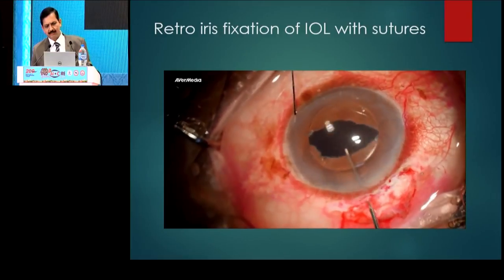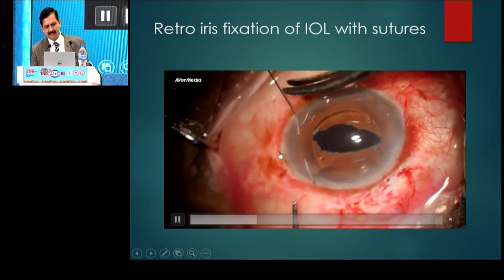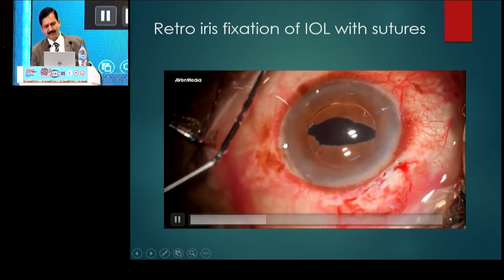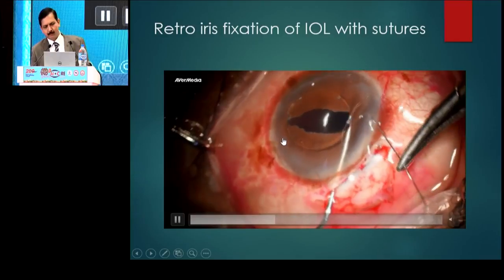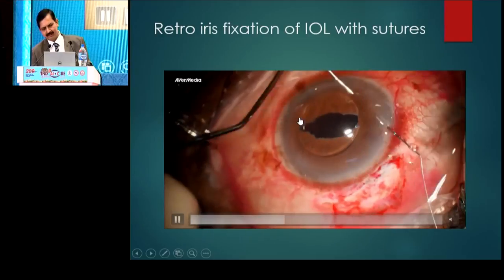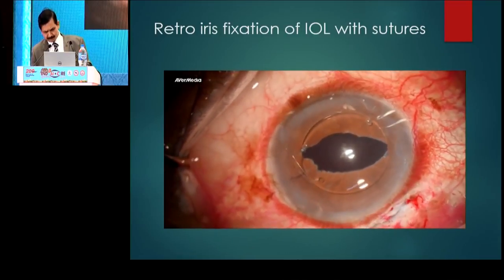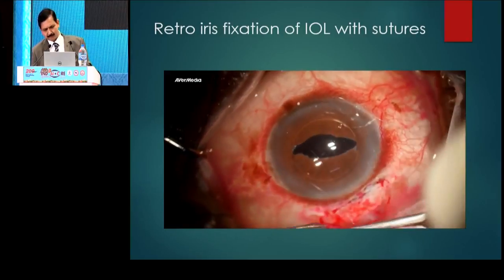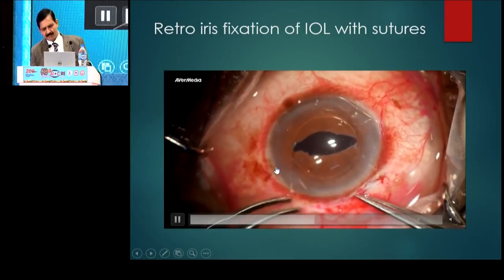Now, as you lift the optic, you can see the IRIS draping the haptic and then you can get the mark of the haptic here. You pass the needle through the cornea, through the mid-periphery of the IRIS and posterior to the haptic, and then come out through the IRIS and then the cornea. The same thing is repeated on the other side. Now the free end is taken out completely and then a loop from the other end which is attached to the needle is taken.